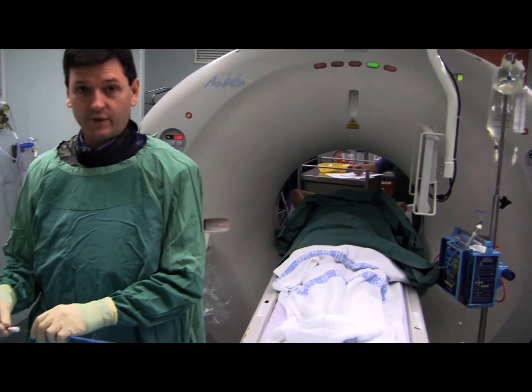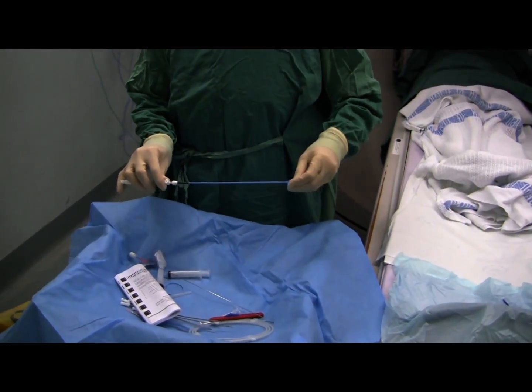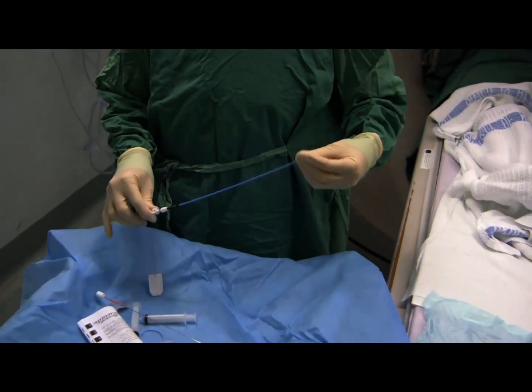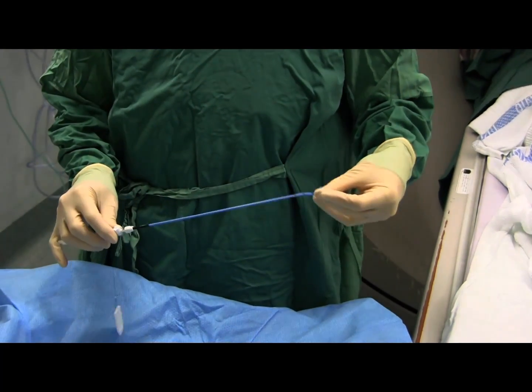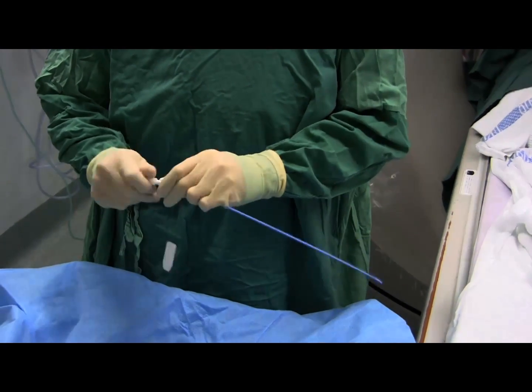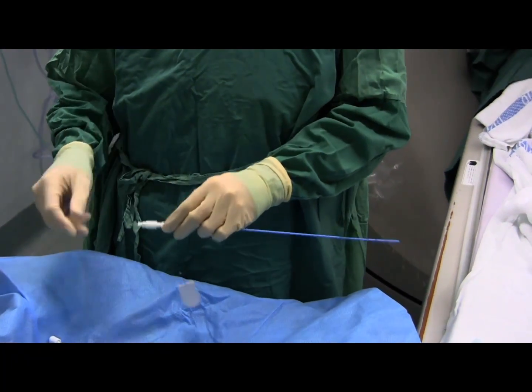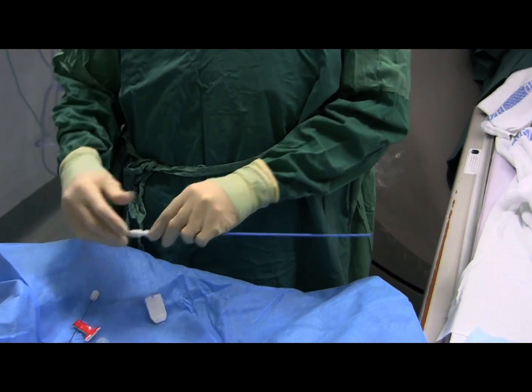This is the drain we're using, which is an 8 French self-retaining drain. It's a very straightforward device, the usual thing we use for most collections. Most collections are thin enough to go down an 8 French drain. You don't need anything thicker. Comes with a stiletto, which we remove.